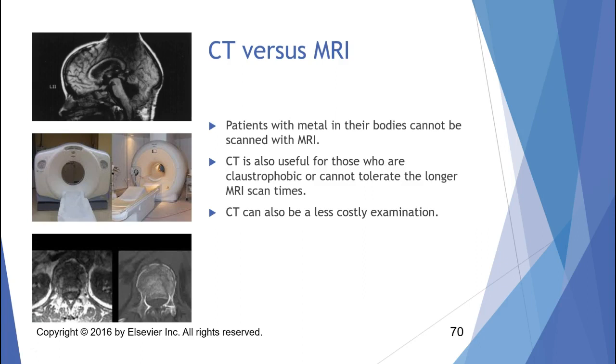Then to acquire the images, it is lengthy. The shortest one that you're going to acquire is probably 15 to 20 minutes, and that's just because you do certain images in MRI that are required, and it usually takes about 4 sequences, and each sequence can take anywhere from 2 to 7 or 8 minutes long. Okay, so a lot of patients cannot tolerate MRI, and CT can be less costly.